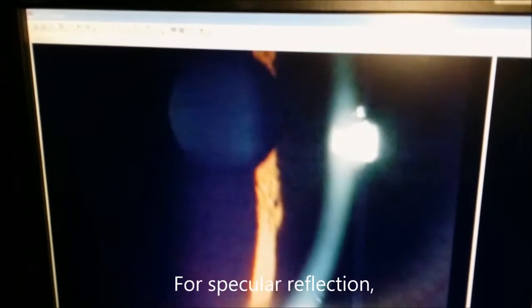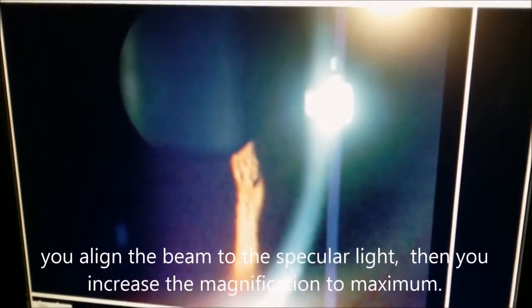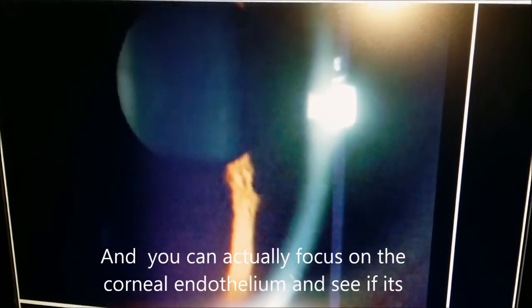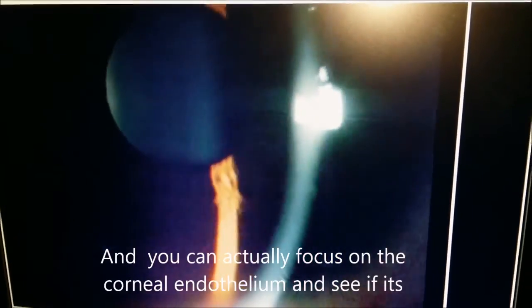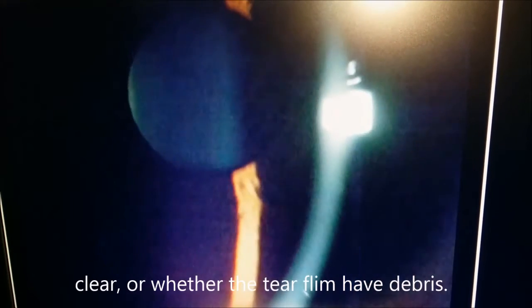For specular reflection, you align the beam to the specular light, then increase the magnification to maximum, and you can focus on the cornea endothelium to see if it's clear or whether the tear film has debris.